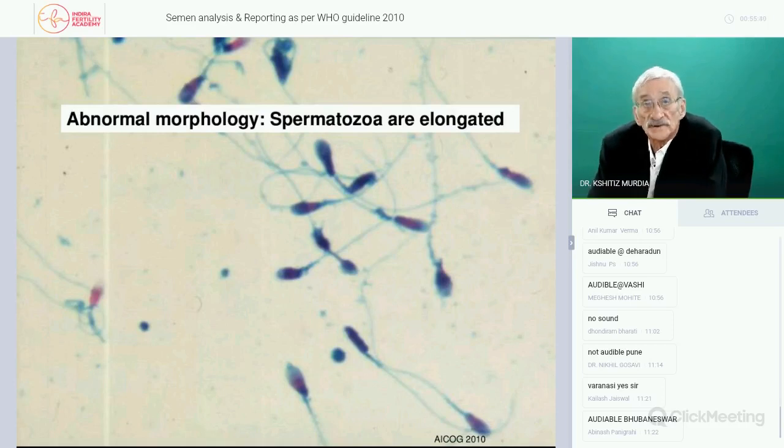This is abnormal sperm. You can see this is a typical picture that you will find with men with a testicular stress pattern, like varicocele, infections or stuff like that, trauma, and you get all these abnormal sperm. It's piriform. Piriform is elongated post-acrosomal area.